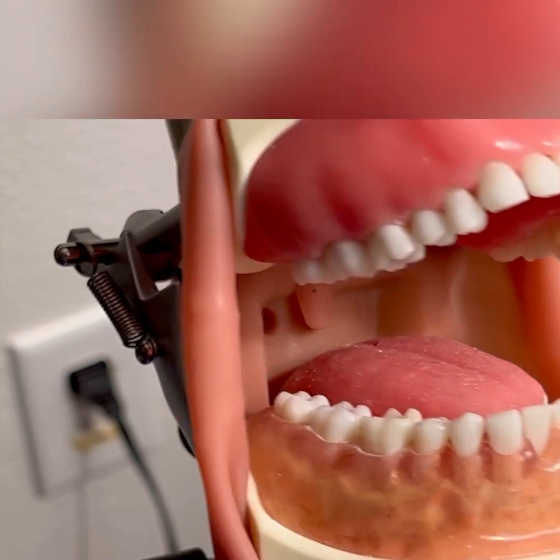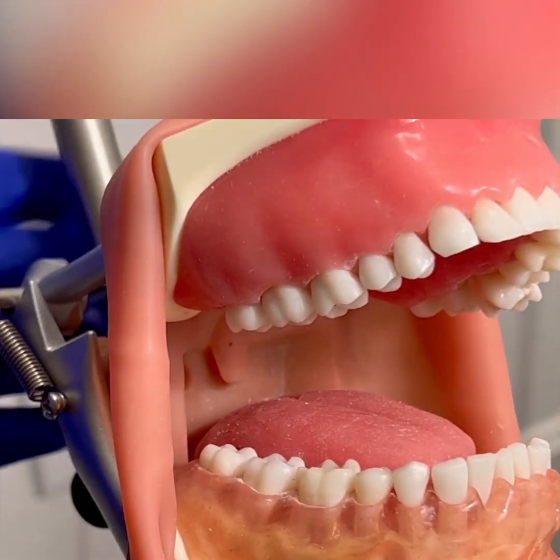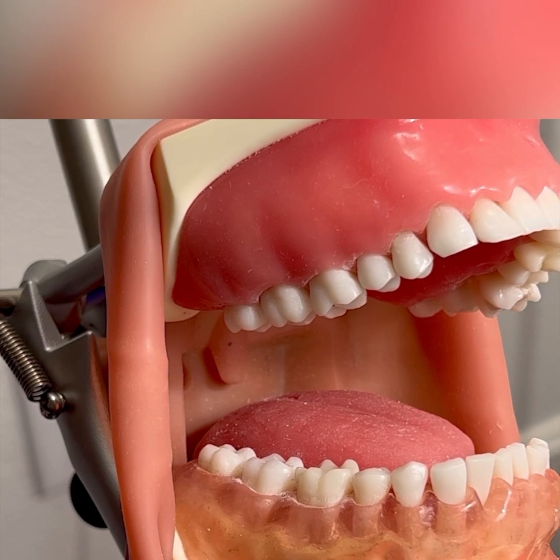Again, with the periodontal assessment, don't forget to chart your bleeding upon probing points, any recession, furcation involvement, mobility, and recession. Thank you.